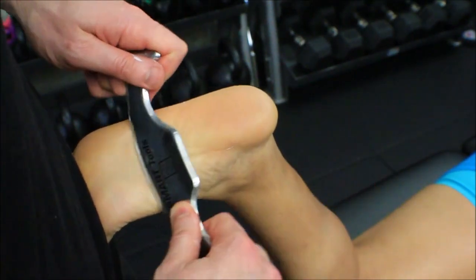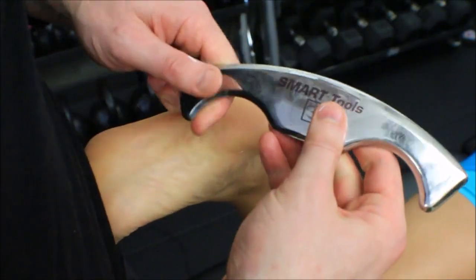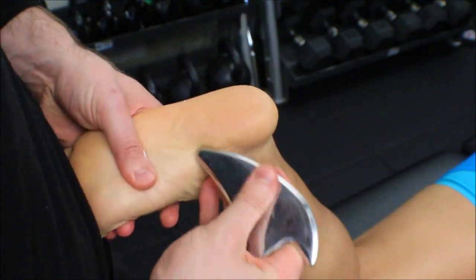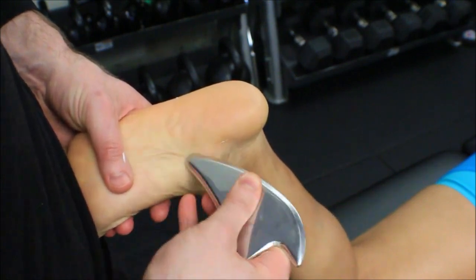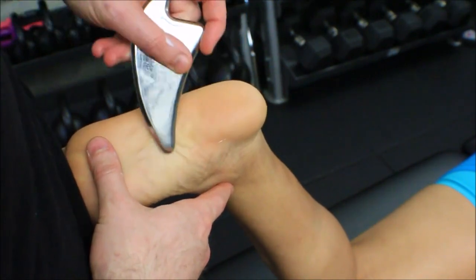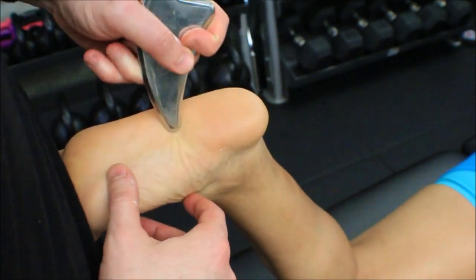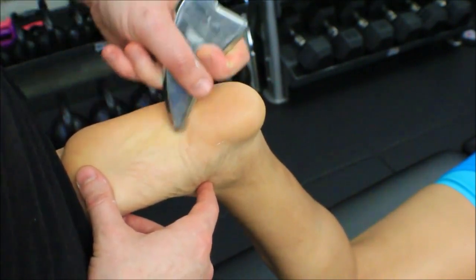So I could do some downstrokes this way, some upstrokes this way. But if I want to do different fiber directions, I'm probably going to have to use a smaller tool, like the shark fin tool. Then I can do almost cross fiber, or cross friction, type stuff. All right, go this way. You guys will notice I'm still at about that 30-degree angle, so I'm not flat to the tissue. I want to make sure I'm dragging some tissue underneath the point of this tool.